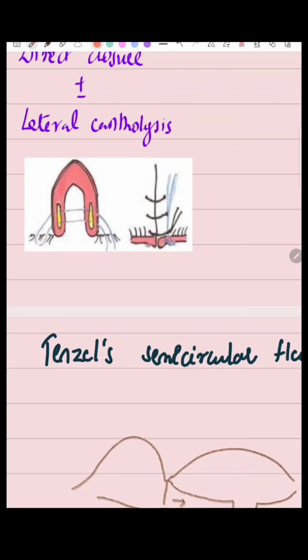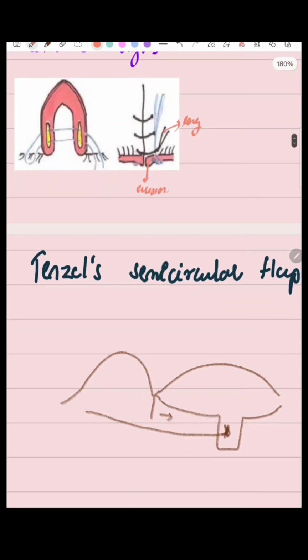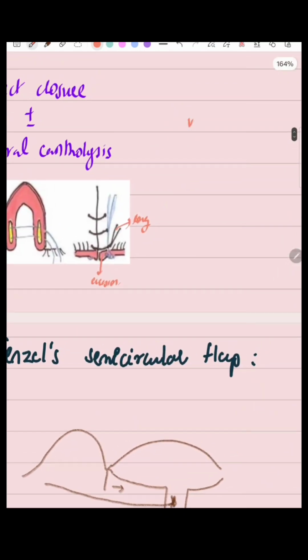On tying the sutures, a slight eversion of the lid margin after repair must be achieved so as to prevent wound contracture once edema subsides. The ends of the gray line and posterior lid margin sutures should be left long so that they can be included in the knot of the anterior lid margin suture to prevent accidental corneal rub. The tarsal plate is closed with partial thickness bites using Vicryl suture, and finally skin is sutured with 6-0 silk.